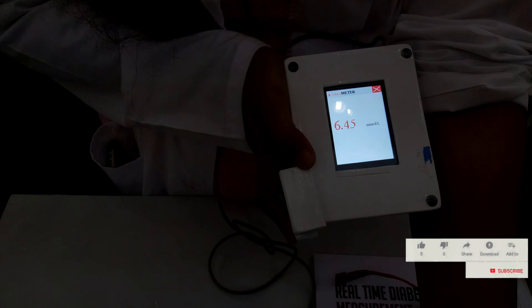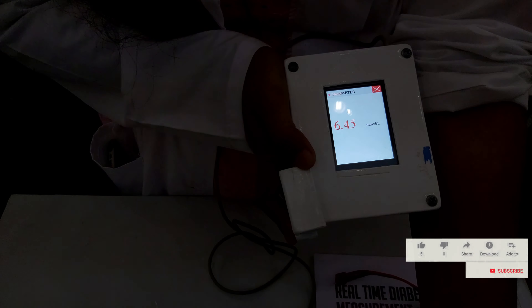You can charge the battery and add the battery. As you can see, you are using this sensor — you can see the sensor on your hand.